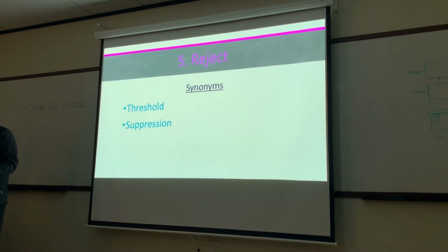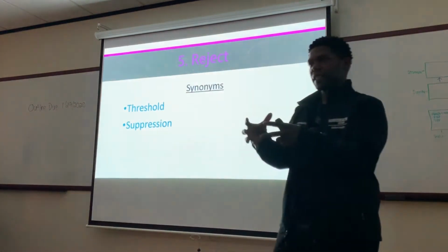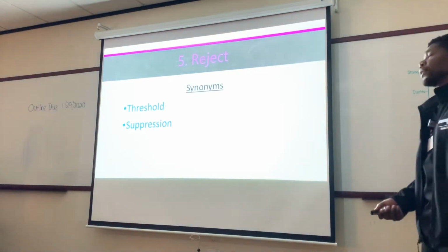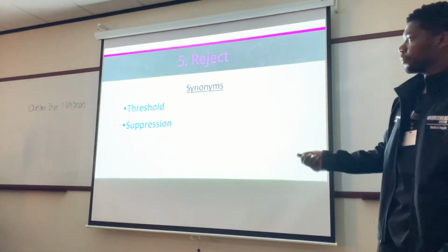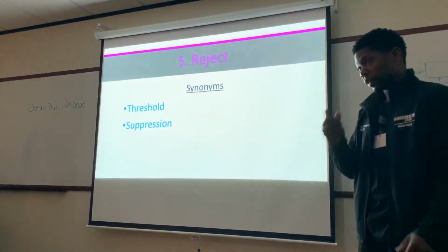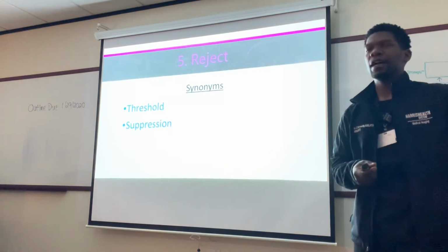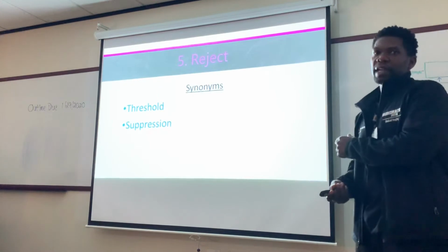So suppression actually means stoppage or reduction of the discharge. So definitely a different term. Compression means having something larger and condensing it to something smaller. So these are the synonyms for reject: threshold and suppression. Threshold, again, is what it's called on our IU-22s. Okay, we have time. I'll show you guys that. I didn't bring the machine in here again because we're on the last receiver function.